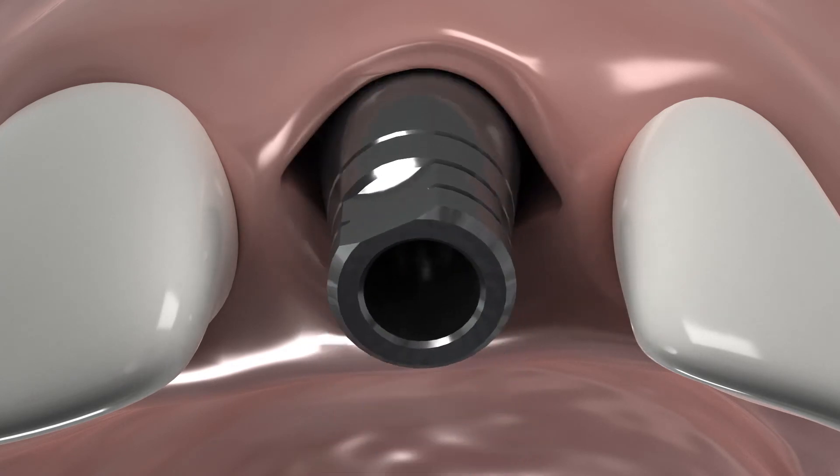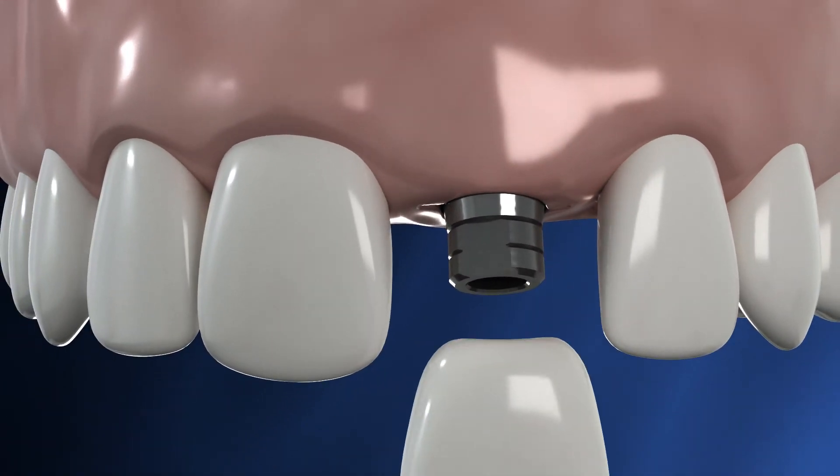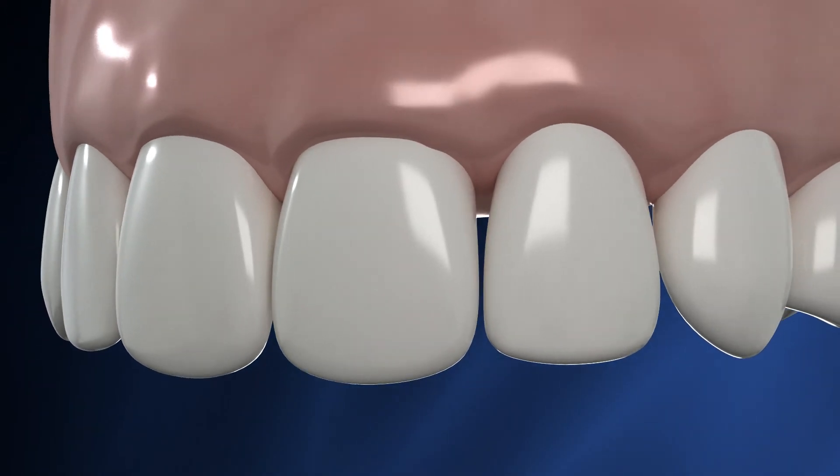Gently raise the soft tissue and secure an abutment to the implant. The excess soft tissue, created by the Pathfinder, is now ready for emergence profile design.